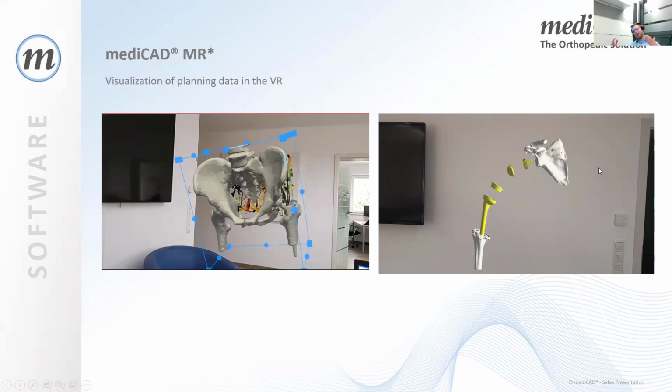Then you can get this information right before your eyes during an operation or surgery. So that was a quick overview of what mediCAD is now and what mediCAD will be in the future.